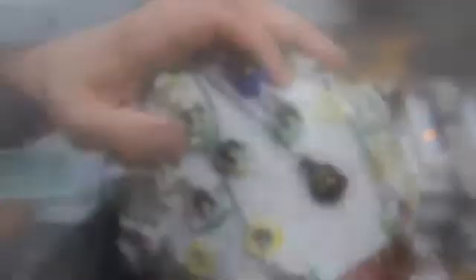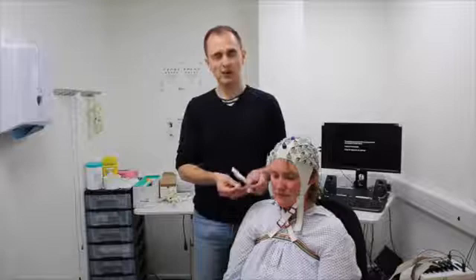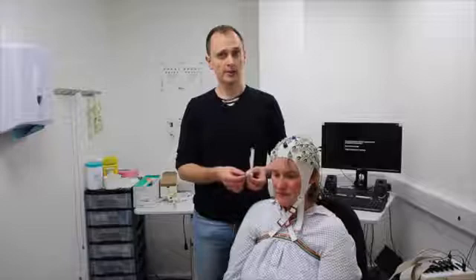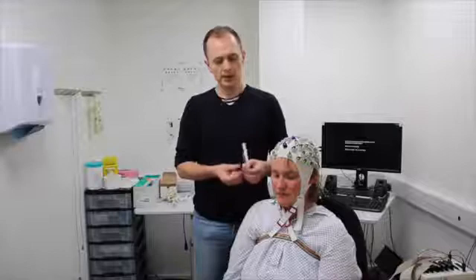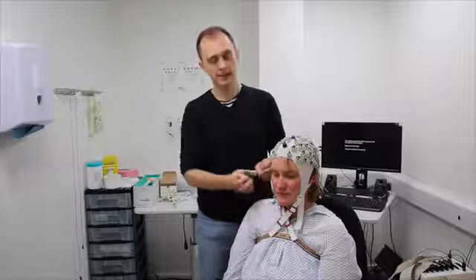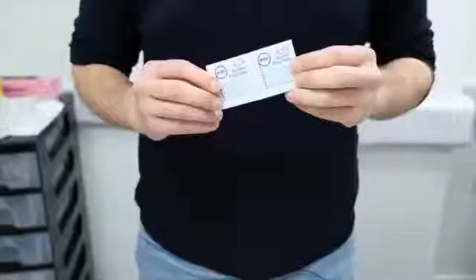Now we need to attach electrodes to the face to record the electrooculogram (EOG) — electrical signals from the eyes that react when people move their eyes or blink. Some electrodes from one of the sets don't have a place on the cap — in this set it's numbers 14 and 9 from the second set, but check your system to identify exactly which ones are for this purpose. These electrodes already have rubber rings attached to them, because we'll attach stickers to them and put them on the face. We'll use adhesive rings to attach them and alcohol prep pads to prepare the face.